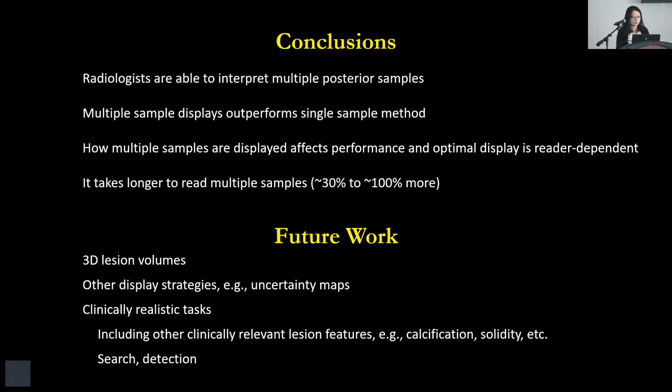The second question, the long tail distribution, is a great question. It applies to rare diseases, for example. But I think that's where the ability to use the data or rely more on the data becomes more important. The training data we're using for the EPS method here is drawn from slices in public CT databases. So more likely than not, more slices are healthy compared to unhealthy slices. We're at least still able to reconstruct lung nodules, so I think that's encouraging, but this is definitely something we should pay more attention to in the future.